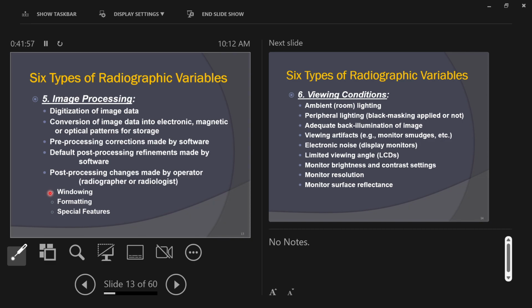But when you take an X-ray and produce an image, if you window that image and then finalize that exam and send it over, do the window changes you make get saved when they bring it up on their computer screens? Most of the time, once you produce an image, you look at it, you're the X-ray tech, you make some windowing changes. Once you click save or send, those changes get sent over. The image that they see on their computer is what you changed to. So most of the time, the changes you make are permanent. But that's open to the different types of software. A plurality of different types of software makes for different ways for this to be done. But as a general statement, what you do is permanent.